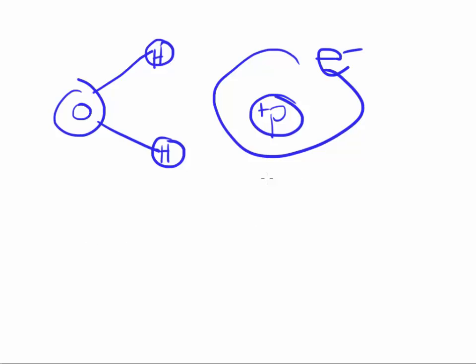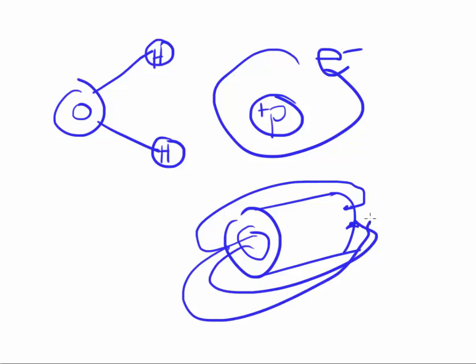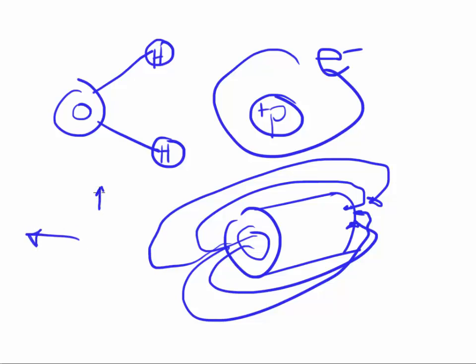So how is it we image? Well, the first thing we have is our magnetic field. In the magnetic field, we find that the protons will line themselves up. Well, why is this? It is because of the charge of the protons. They line themselves up because they have a charge and therefore a magnetic field. Normally, the protons in your body are in all different directions, basically an infinite number of directions given the vast quantity of protons in your body. These can be in so many different directions that if we were to try to impart signal to these protons, they would simply cancel out. That wouldn't do us any good.